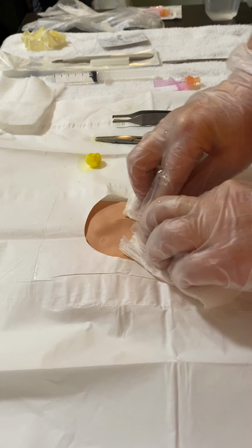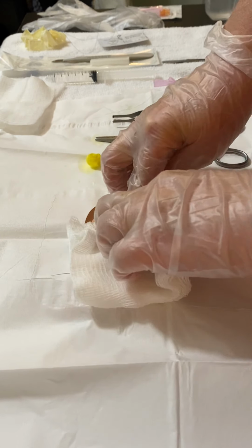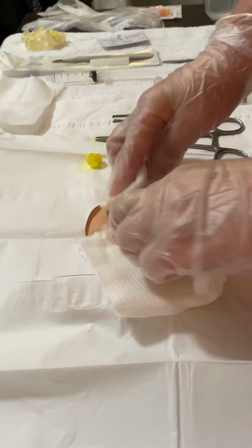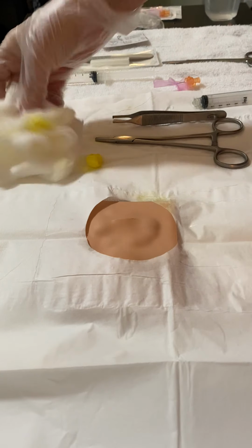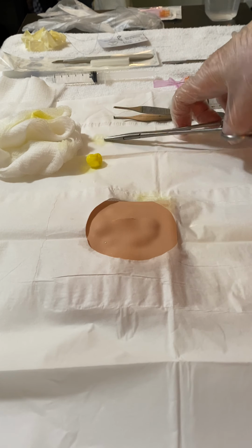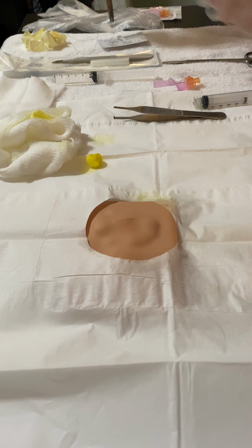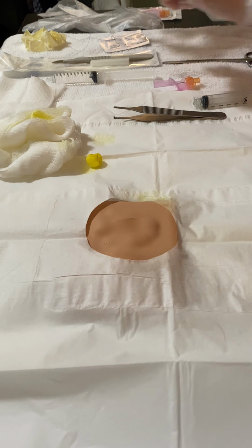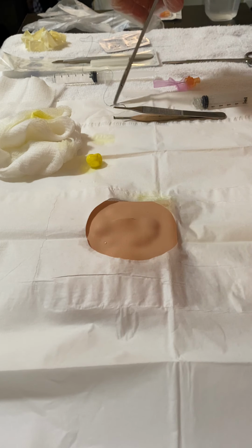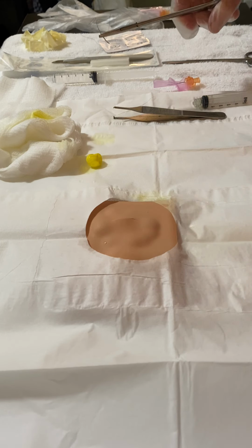And once we had a good idea that all of the material, the fluid, and any remaining portions of the sac are clear from the cyst cavity, we can then proceed with suturing the area. So this would all, of course, be a part of my sterile field.